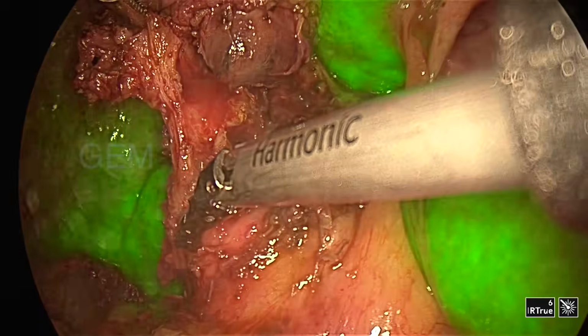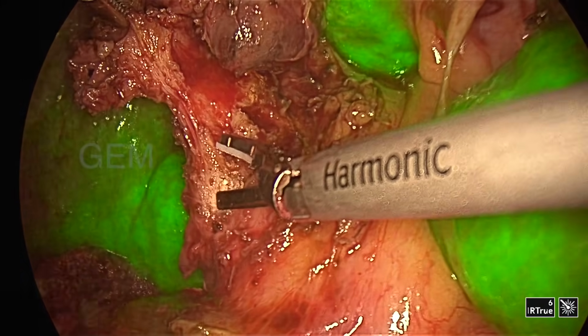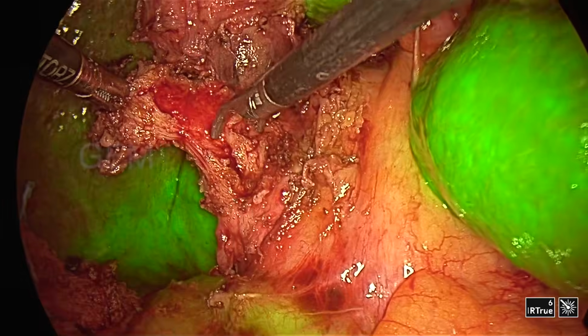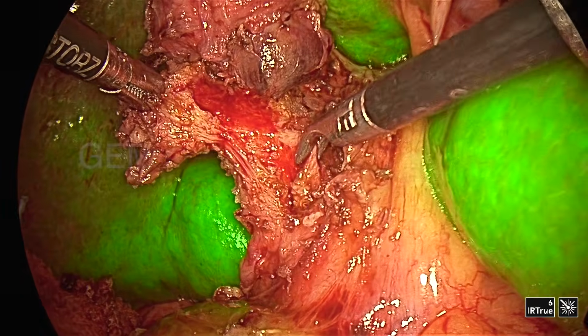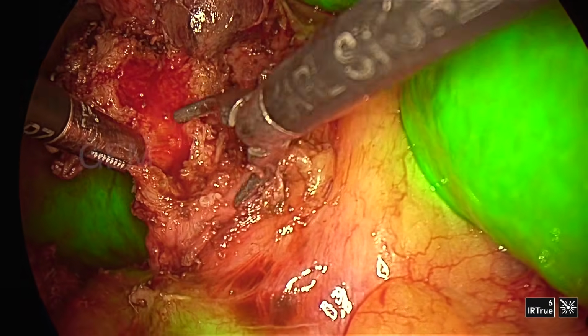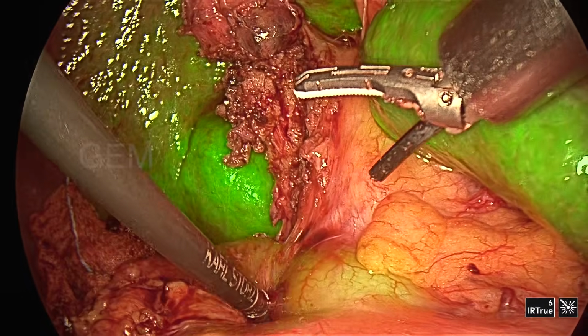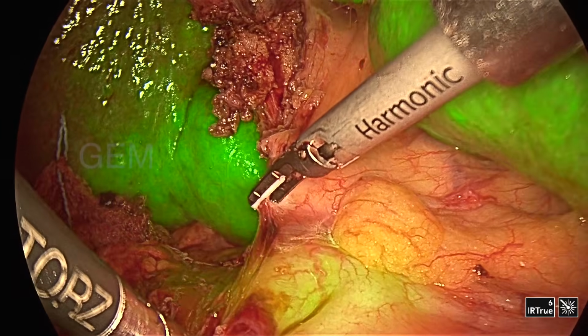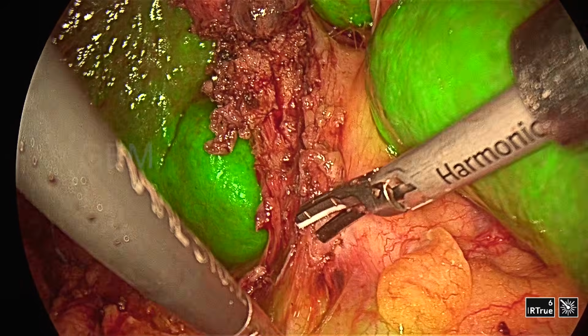So it is really helpful. ICG is really helpful, and the camera surgeon, my surgical gastro postgraduate, is telling me each and every time, sir, it is really helpful, sir, ICG is helpful. He told me, sir, without ICG we cannot do this case. So it is definitely helping.